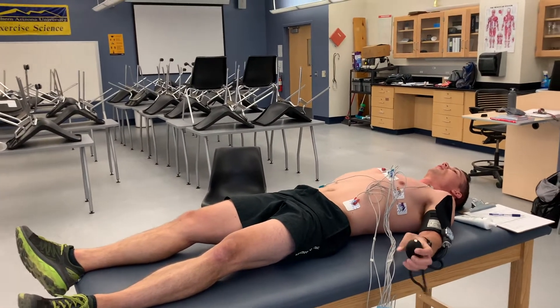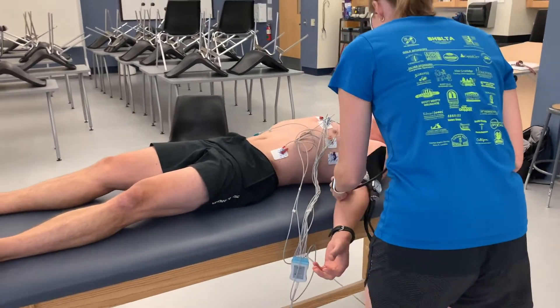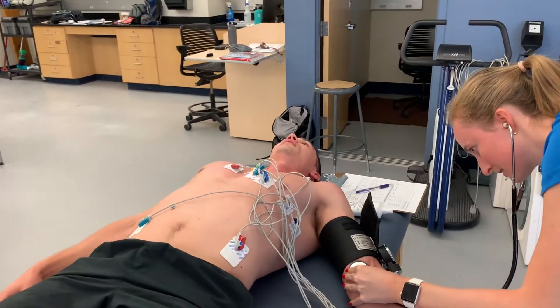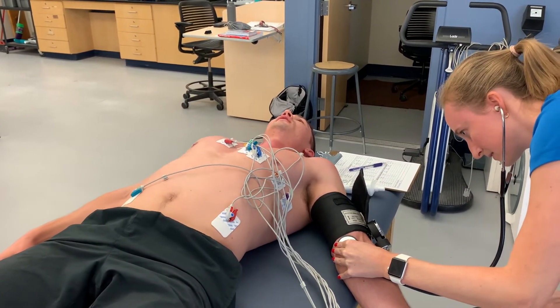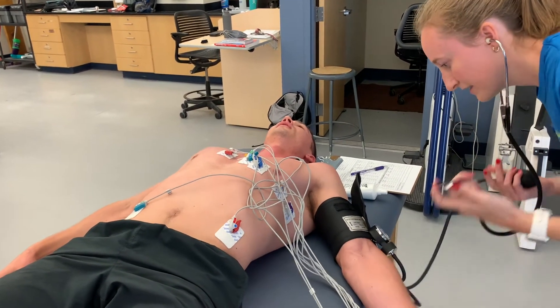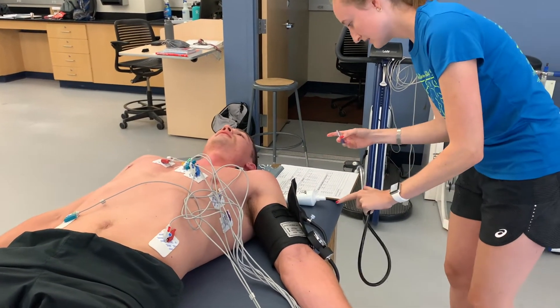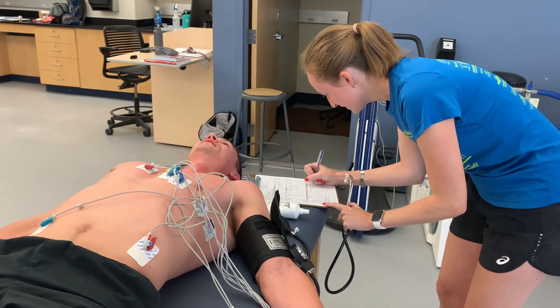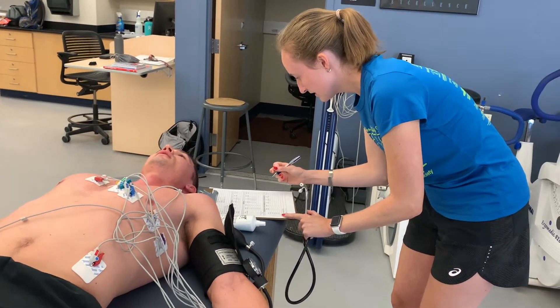We're going to get that 30-second blood pressure. Just relax that arm. We're at about 186 over 84, and his heart rate was 120.